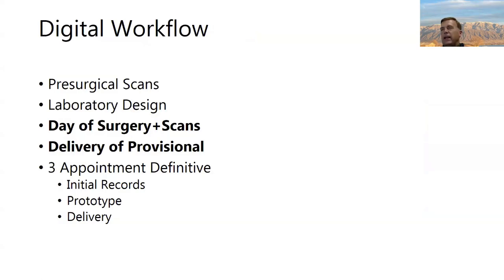All right, so here's our slide again. So we took all the records, we got the pre-treatment plan done, and now we're ready to do day of surgery and get the person in a provisional. And again, this will be a day after provisional.